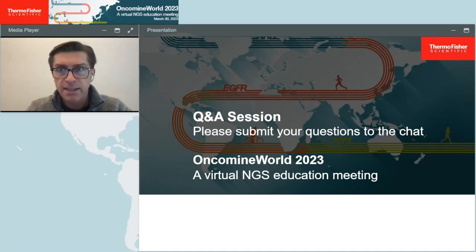All right, I see the first question here is, there have been a lot of new sequencing instruments released recently, including the Element Biosciences Aviti, the Singular Genomics G4, and Illumina NovaSeq X, just to name a few. How does the Genexus compare to these?